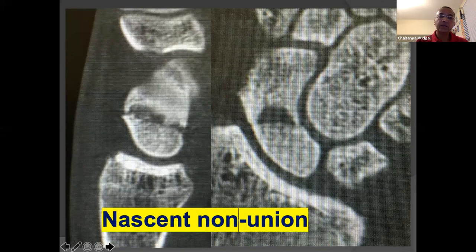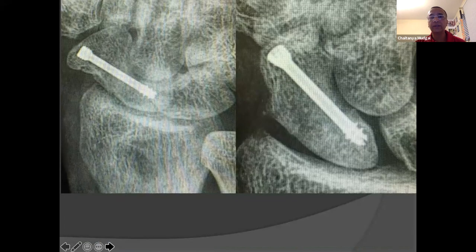And you can understand why, because look at the location of the fracture and the non-union. It is a B1 fracture well within the confines of the scapholunate interosseous ligament, therefore suggesting that there is no humpback. So for me, this was an ideal indication to fix with a screw and graft from the distal radius, which you can see where I've harvested it from, without having to resort to a tricortical or a trapezoidal graft with a predictable outcome.